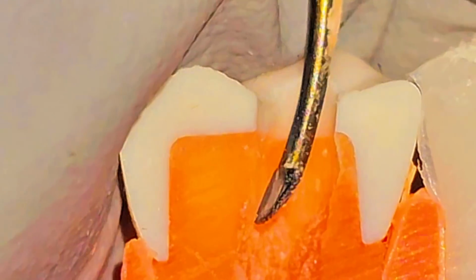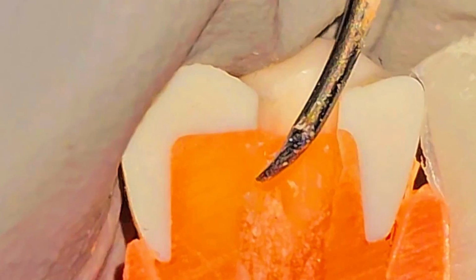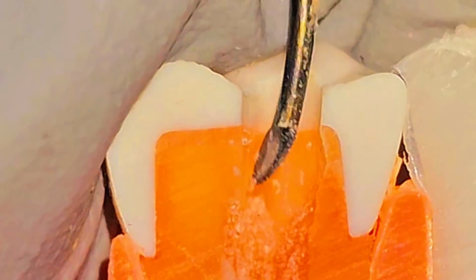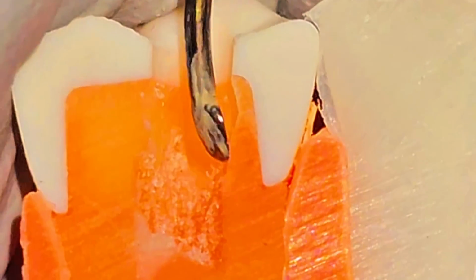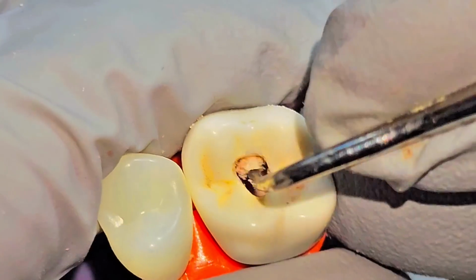So it should be straight so that we will not leave any pulp tissue at this corner, the roof area. It should be straight like this. Straight like this. Okay, so keeping it in your mind, we are going to unroof the pulp chamber.